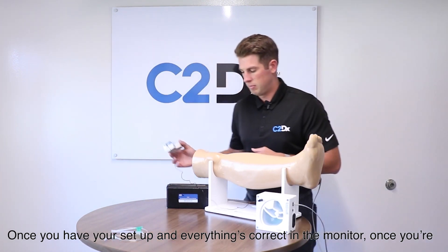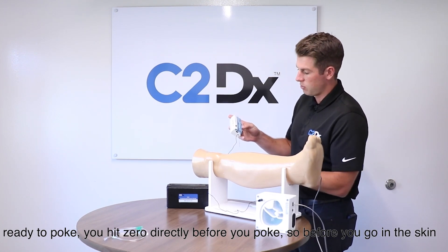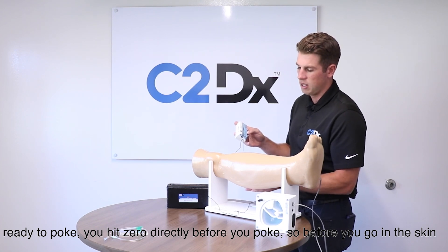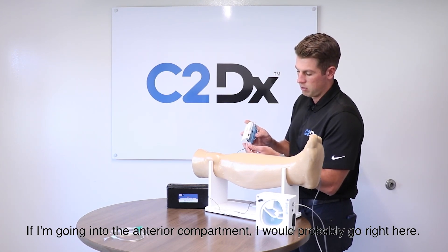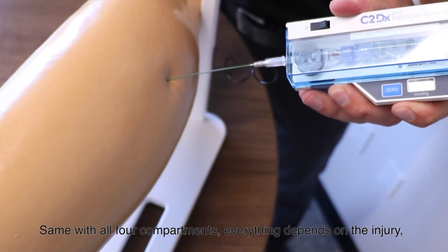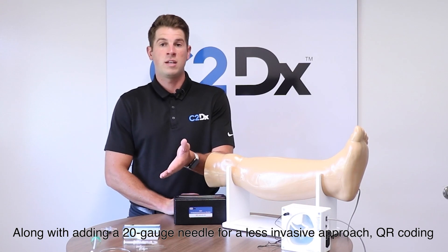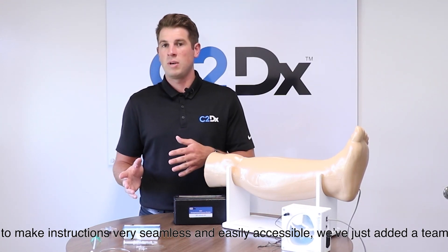Once your setup is correct and the monitor is ready, hit zero directly before you poke — right before you go into the skin. If I'm going into the anterior compartment, I would go right here. The same approach applies to all four compartments; everything depends on the injury, what happened, and where it is along the leg.